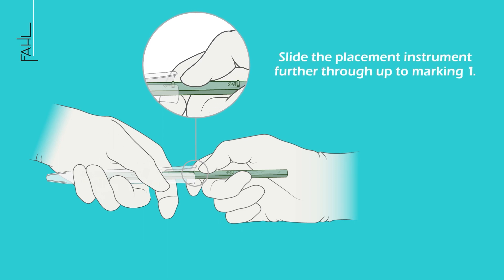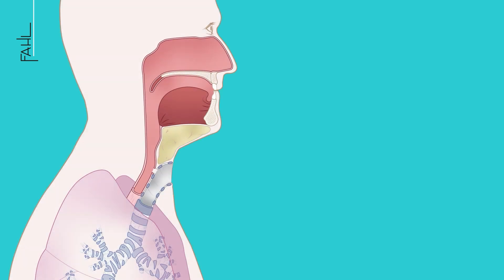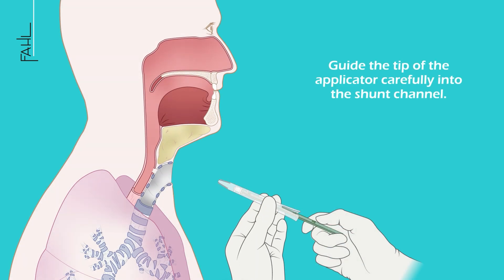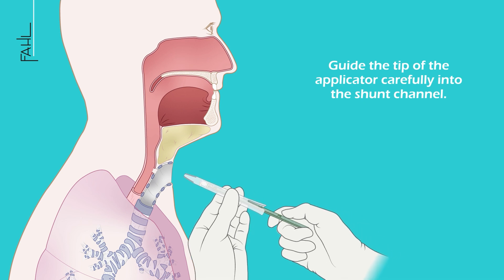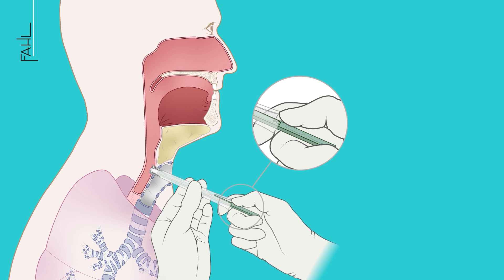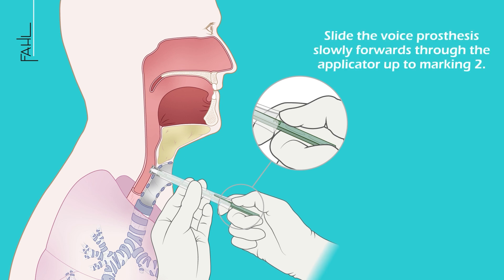Slide the placement instrument further through up to marking 1. Now place the voice prosthesis. To do this, guide the tip of the applicator carefully into the shunt channel. Slide the voice prosthesis slowly forwards through the applicator up to marking 2.